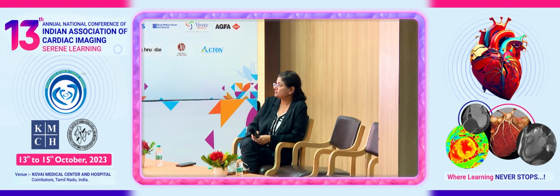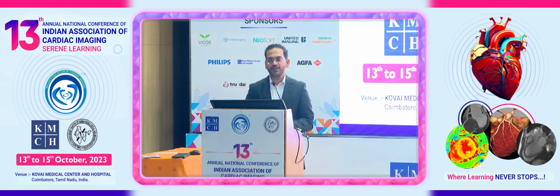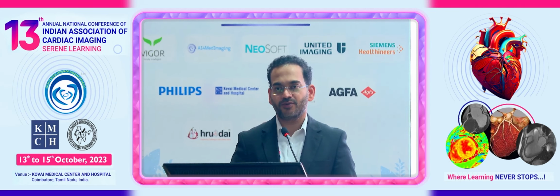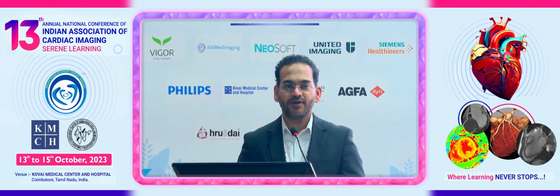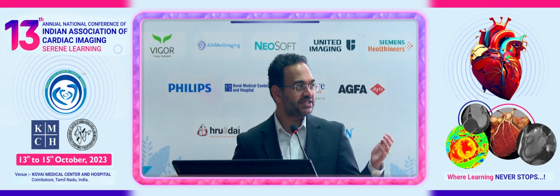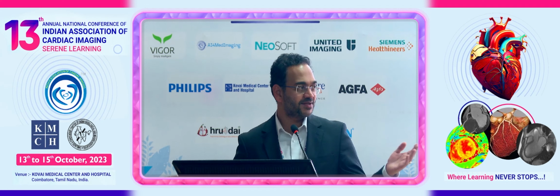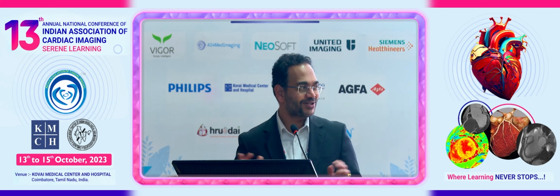100% agree. In my hospital in Boston, as I mentioned before, we meet twice a week. Every case that is undergoing TAVR or TMVR, TPVR, doesn't matter the type, every case, echo and CT, is reviewed together in a multidisciplinary approach, and we warn them ahead of time if we see something that might complicate. As Mona said, we've picked up masses, aneurysms, vasculitis, all sorts of complications.